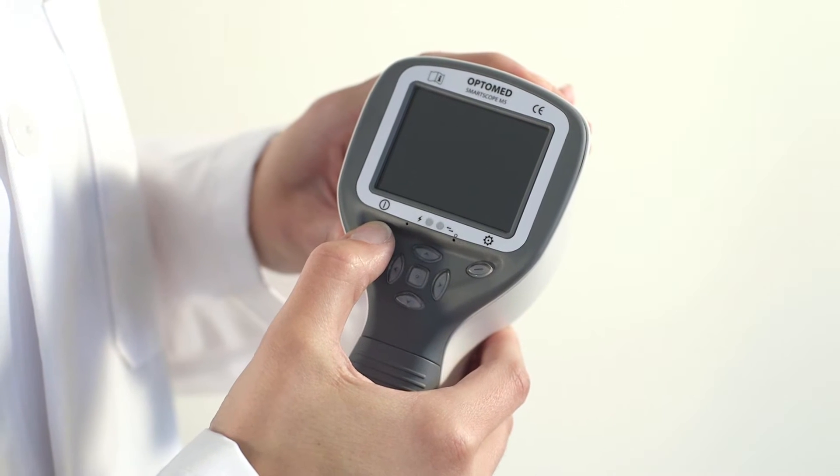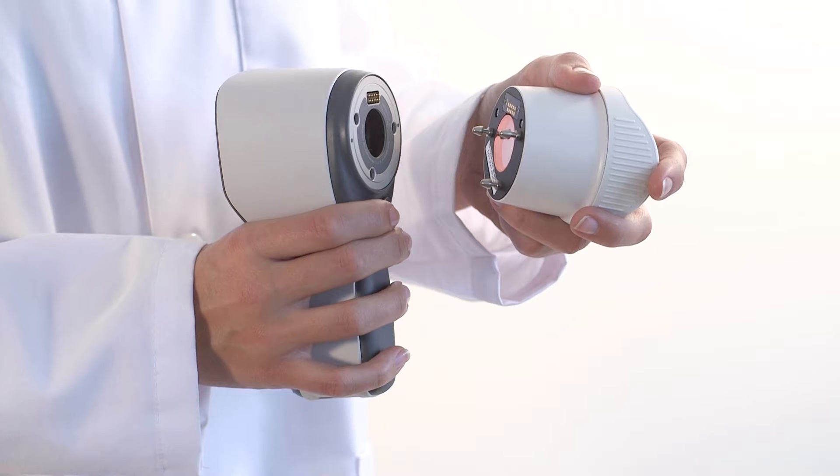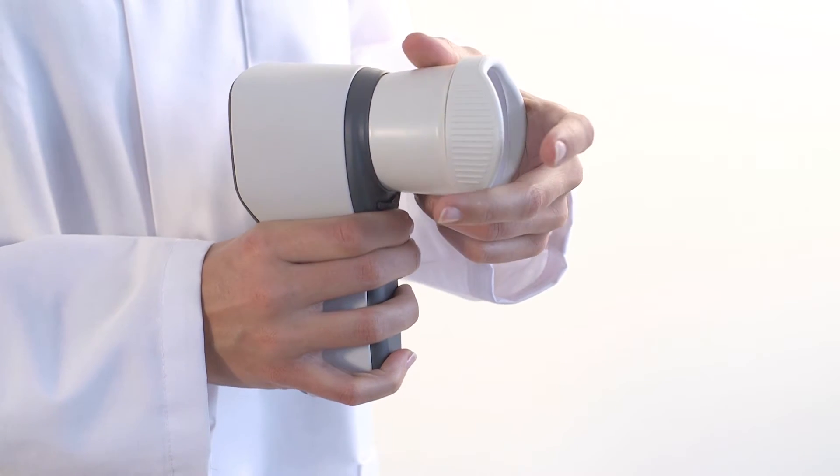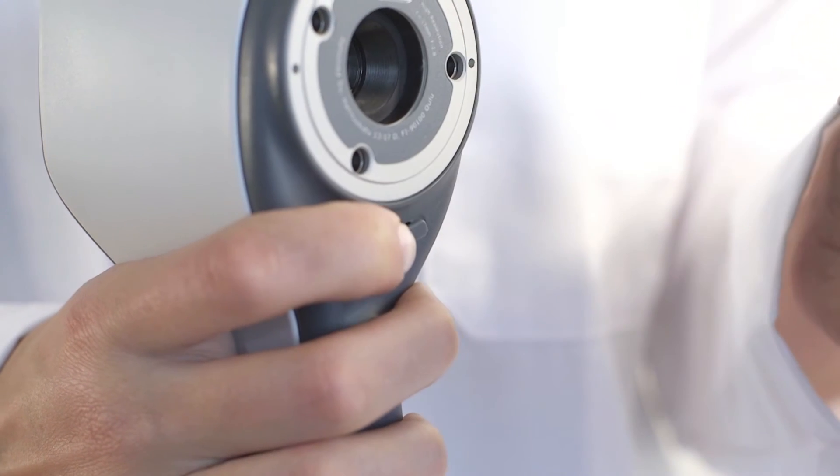The device is powered on and off by pressing the left soft key. Attach the optics module by pressing it firmly into place. To detach the module, slide the release button.